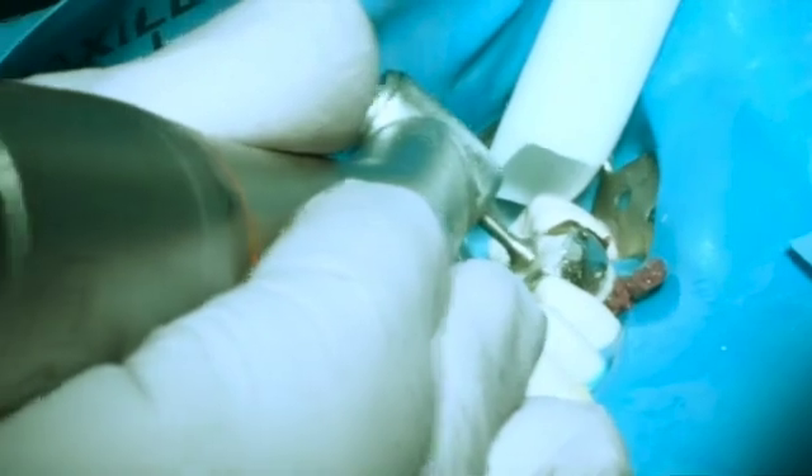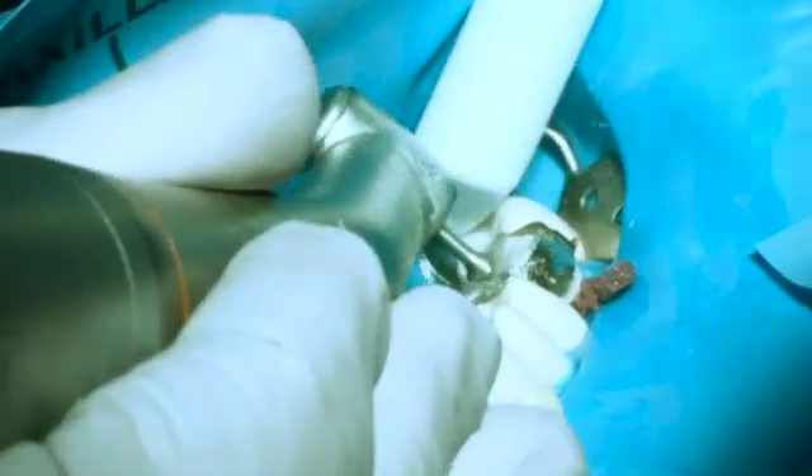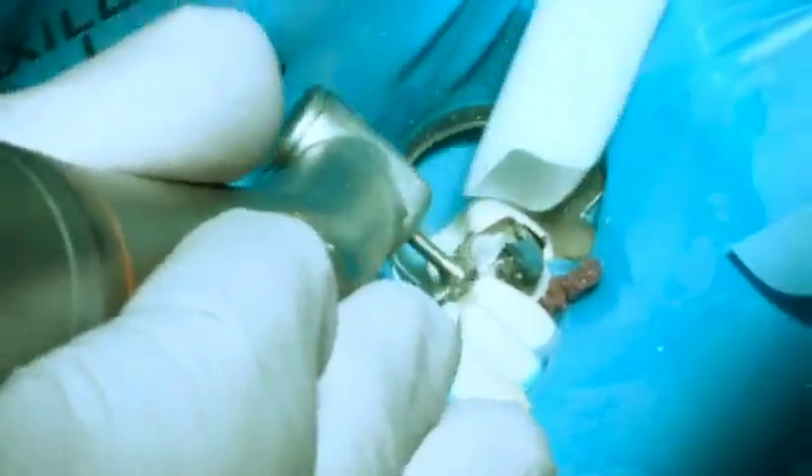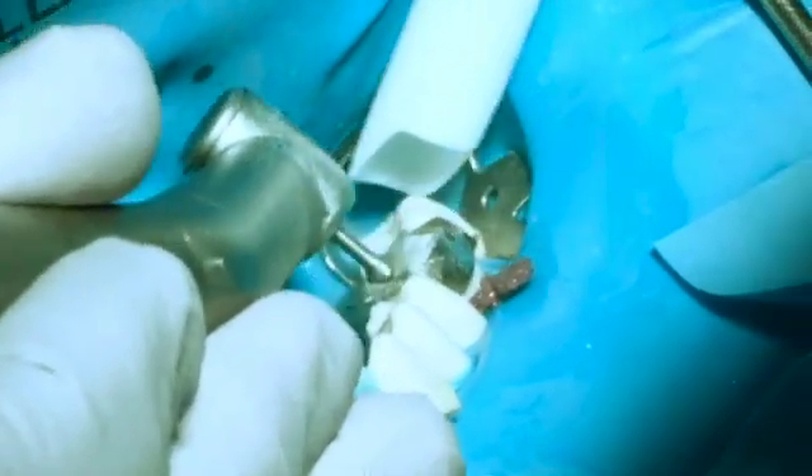The reason I use this 50-micron is because it leaves a very smooth surface. And yet when I go to finish those planes, I'm going to go to a Christmas tree burr, which has a 15-micron diamond. What that's going to do is not just finish them, but also polish them to the point where I really don't need to go in there with any polishing points — another time saver.